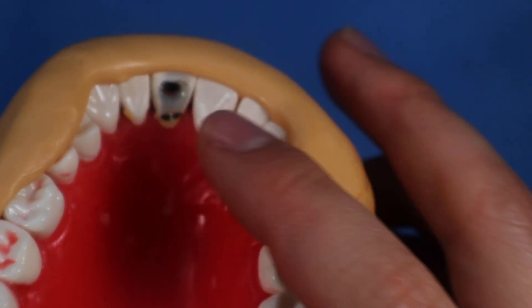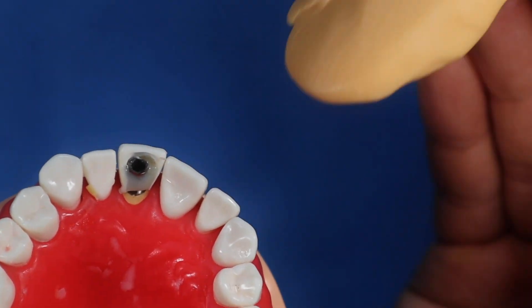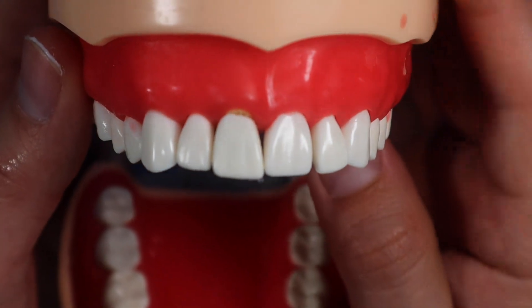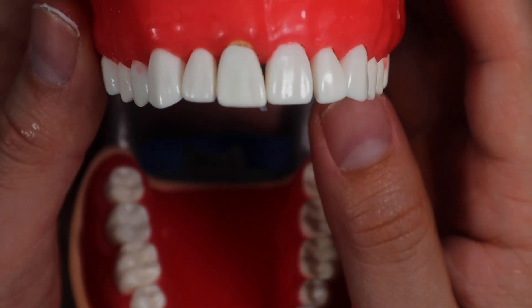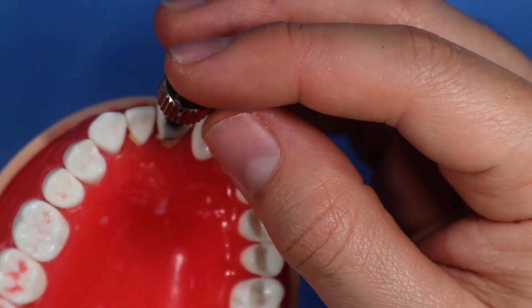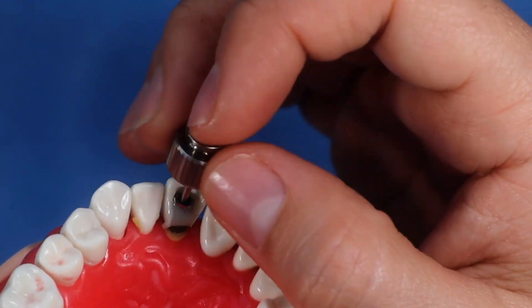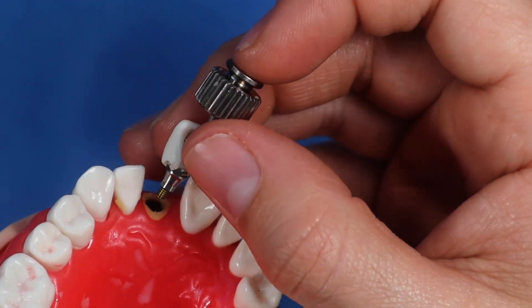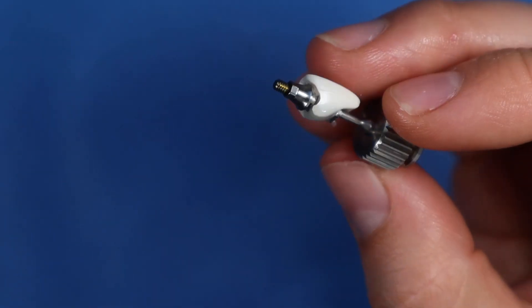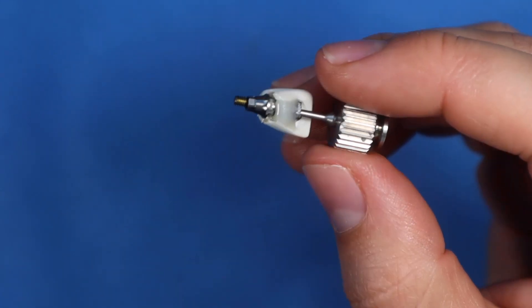Now you can take off your putty matrix and you have at least initially the beginnings of an immediate loaded temp. What you do now is get your driver, put it into the access hole, and pop this off really carefully. When you take it off, you can do a lot of fine tuning and polishing, making sure you have a nicely fitting temporary. Right now you want to go ahead and fill in all the voids and polish everything.